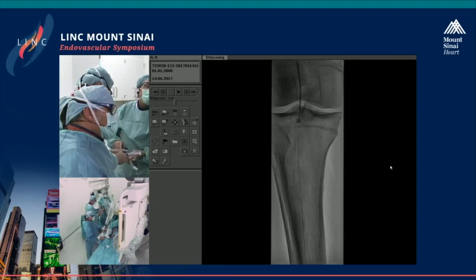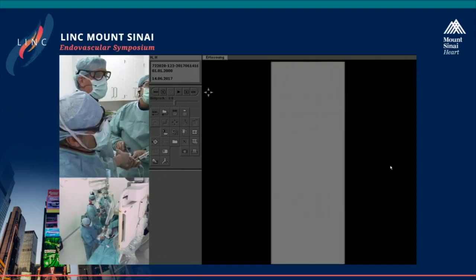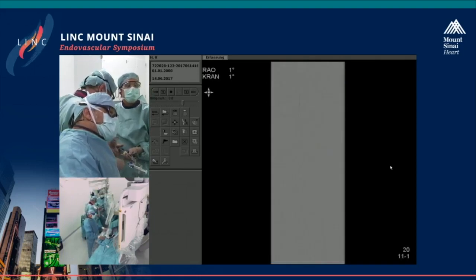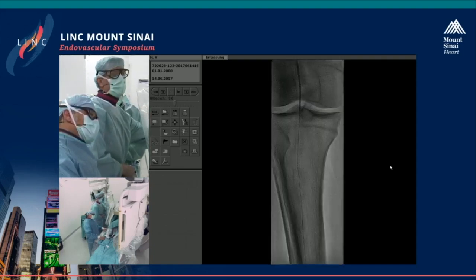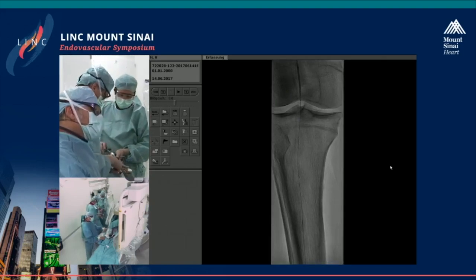So Dirk, when you use this strategy, are you undersizing the balloon? First with your angioplasty and then delivering drug, and you're trying to stop at a 1-to-1 angioplasty followed by drug delivery? What's the strategy? Well, actually we go for 1-to-1 dilatation, and then we perform the drug delivery, and typically after that we are done. So we always check.